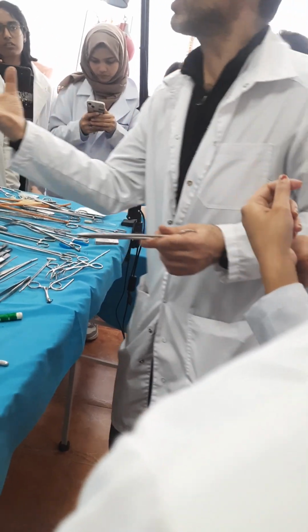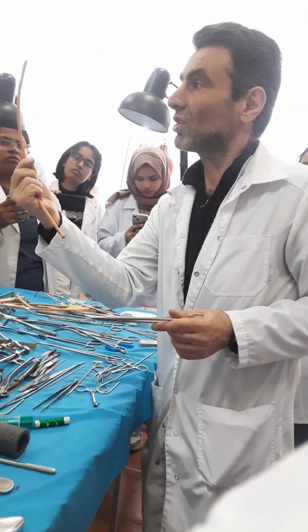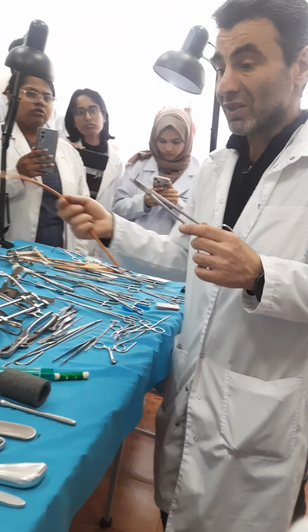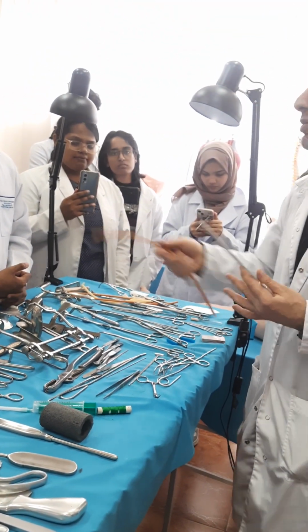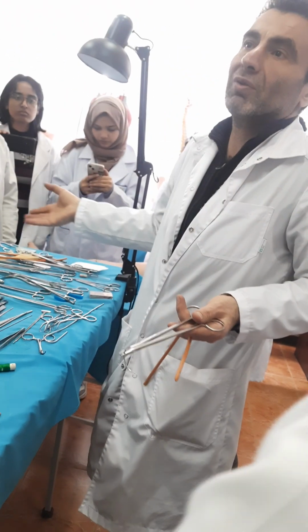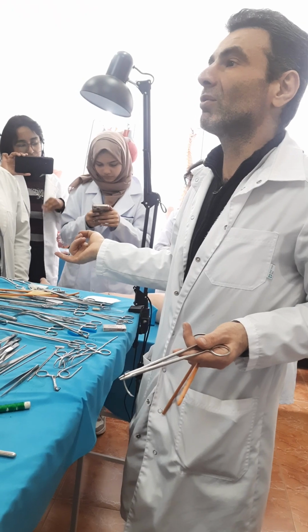Because of high elasticity. Now imagine that you need to perforate this rubber structure. If you have a piercing needle, you will break it, because I must not only pierce, but I must cut it a little bit. You understand me? Vice versa, you work with the intestine. Do I need to make a big hole? No, of course not. Even with a finger I can perforate it. Why do I need the piercing one?